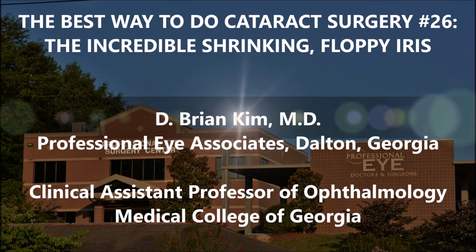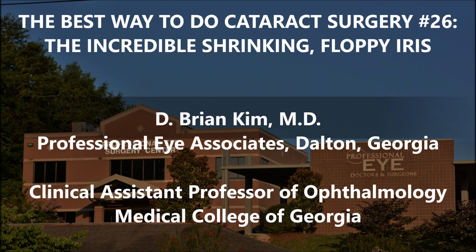Hi, this is Brian Kim. I'm going to share with you case number 26 in the best way to do cataract surgery series. This is a patient who has floppy iris syndrome. I'm going to show you how, despite using epinephrine and viscodilation, this patient's pupil came down quite a bit. But using mechanical fracturing — double chop, cross chop — using only mechanical forces to break up and disassemble the lens, I was able to remove this lens very carefully and safely, despite the iris coming towards the tip. I'm able to gently disengage it and resume the case without needing any iris retractors, rings, or hooks.